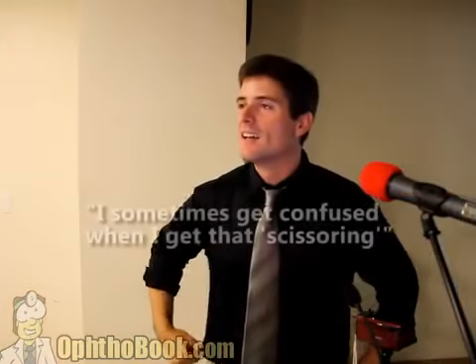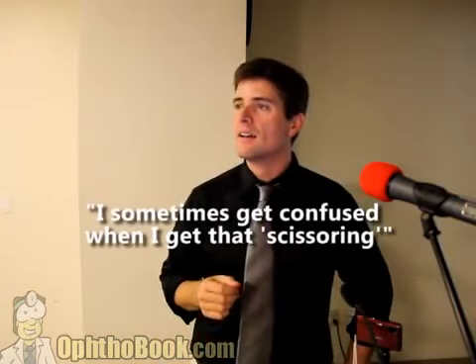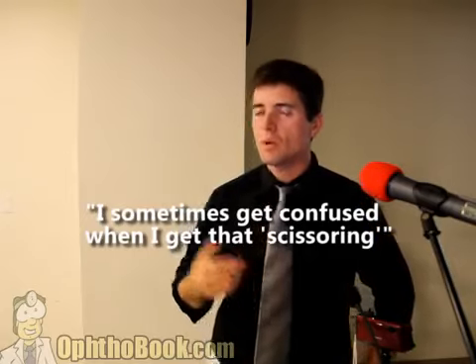All right, so, yes? I sometimes get confused when I get that scissoring. Yes. Well, we've been assuming that the eye is a perfectly spherical structure, and the lens is perfectly spherical, and it focuses at a single point. But the reality is the eye has a fair amount of aberrations. The cornea is not perfectly spherical.